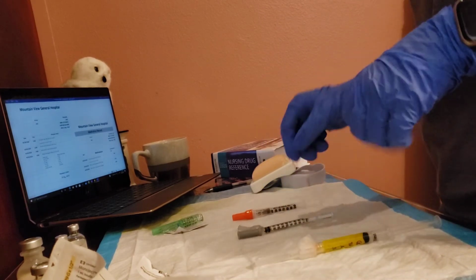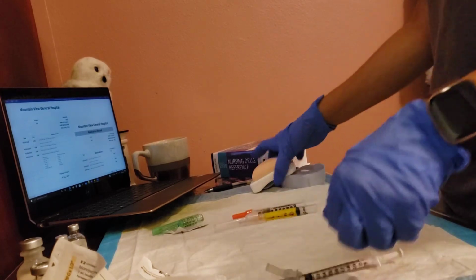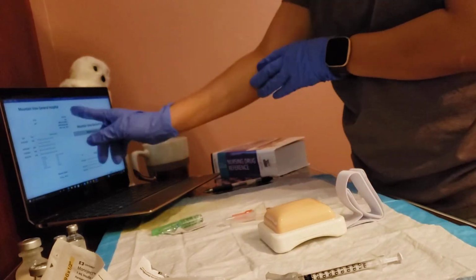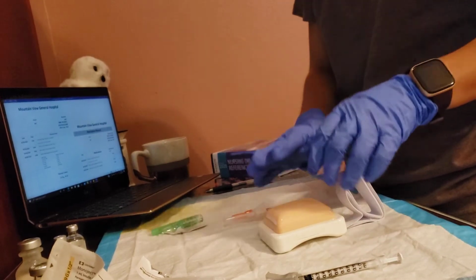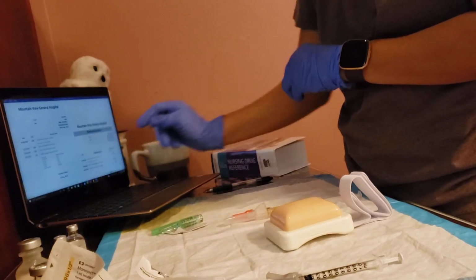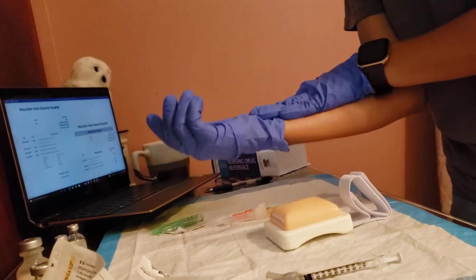And I'm gonna start from my least painful to my most painful. So I'm gonna start with my PPD first, and I'm gonna want to do it on Mr. Buzzard's forearm area. So in my order, I am giving you, Mr. Buzzard, 0.1 ml intradermal here, in your forearm, and I will be reading it in 48 to 72 hours. Okay, so I'm gonna do it in his forearm.